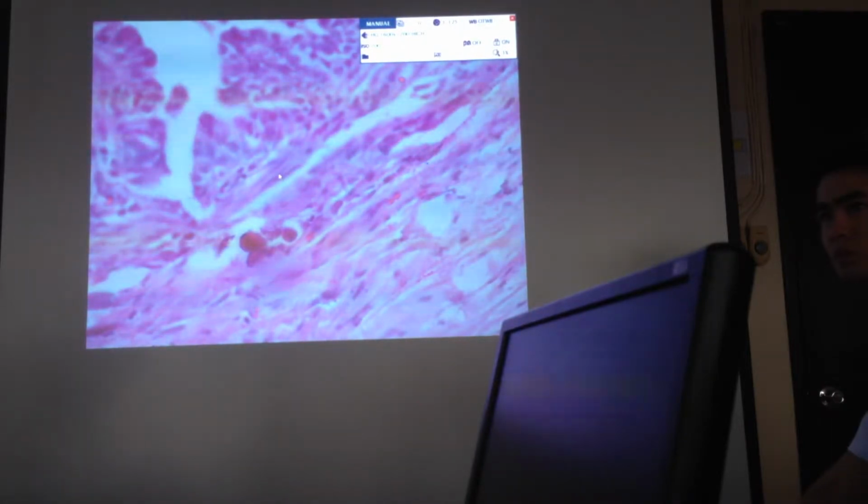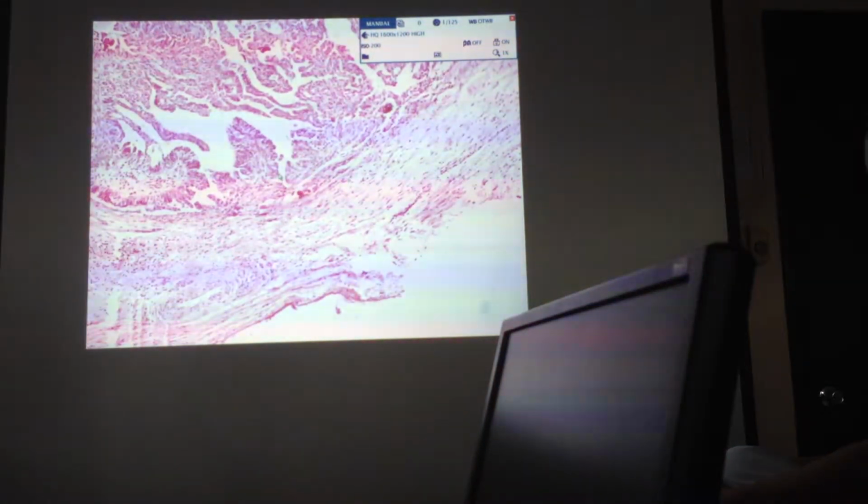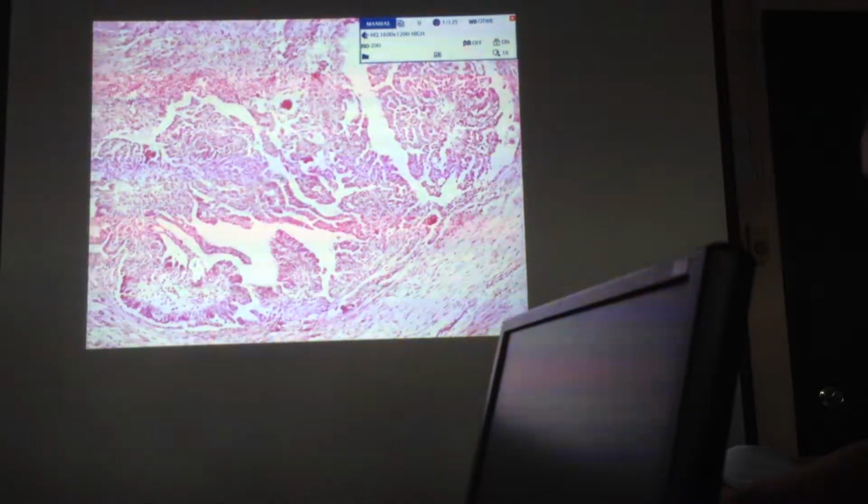So when we go into endocrine pathology, you encounter the papillary carcinoma of the thyroid, you can see this. It can be encountered in any papillary neoplasm, whether benign or malignant. So it is not necessarily that when you see a psammoma body, you would say this is malignant. It can be seen in benign or malignant neoplasms, papillary type. So anywhere in the body, as long as it's papillary, there's a chance that you will see psammoma bodies.